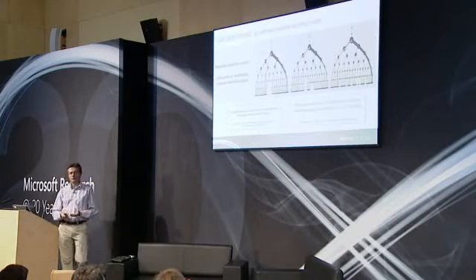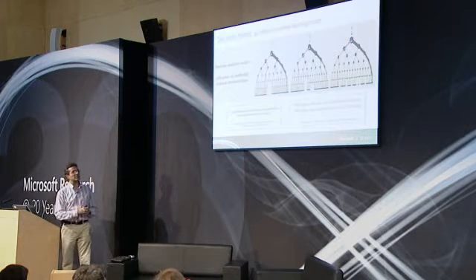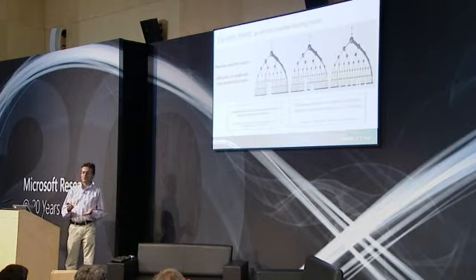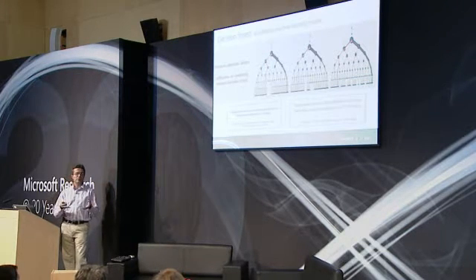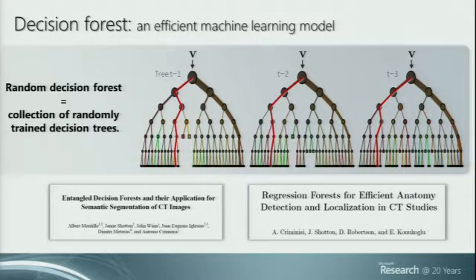The underlying technique and the algorithm is very, very similar to the engine which underlies Kinect. You will hear more about Kinect. Both projects, the medical project and the Kinect project, share a lot of the underlying technology. The underlying model is called random decision forest. And what's interesting is, as I was mentioning earlier, that the two projects have been enriching one another. Both camps have been making progress, not just in the application per se, but also in the overall machine learning principles that make everything work.